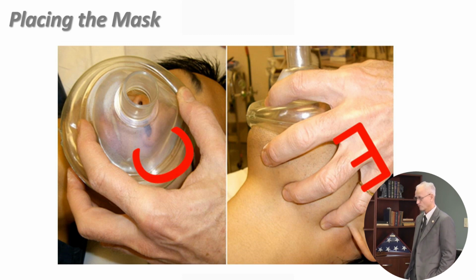Be sure you don't sedate them. Very difficult. You may not be able to get a good seal because, let's face it, if they've got a full beard, I'm glad you brought that up, because that's an indicator of having a problem if you have to breathe for them. That might be one where you have to end up putting in an airway, which you don't want to do, but at least it's better than trying to intubate them. But they could gag on you too.